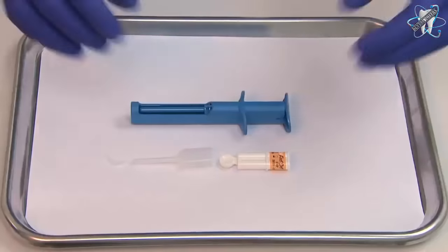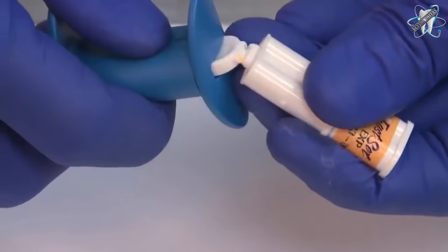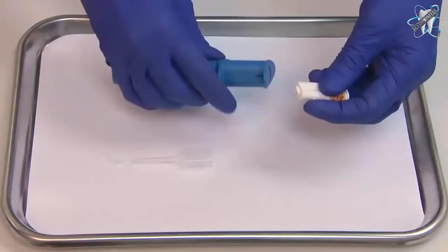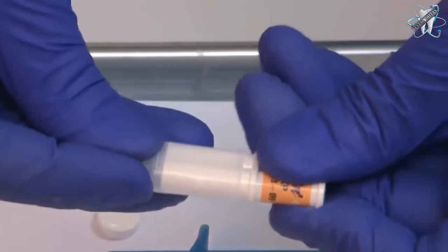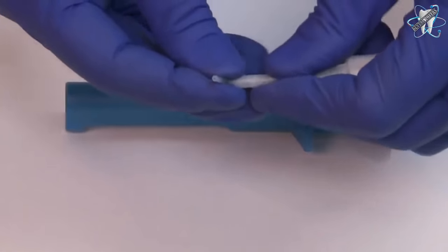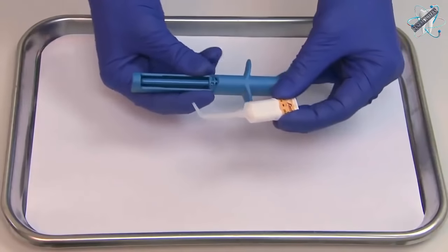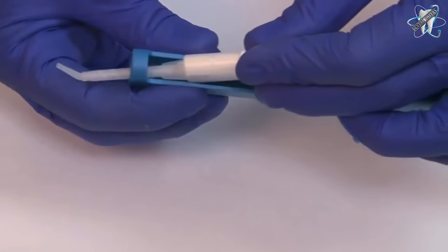The single unit procedure kit comes with two wash material viscosities: LV, light viscosity, and XLV, extra light viscosity. We will be using the AquaSil Ultra XLV as our wash material for maximum flow capabilities. Prepare the digit-targeted delivery system designed for convenience, precise placement and minimal waste of wash material.